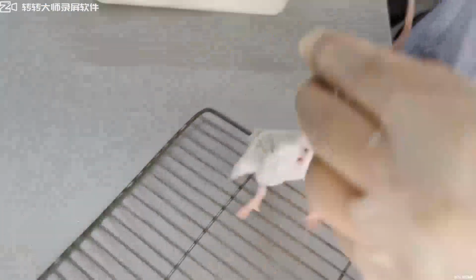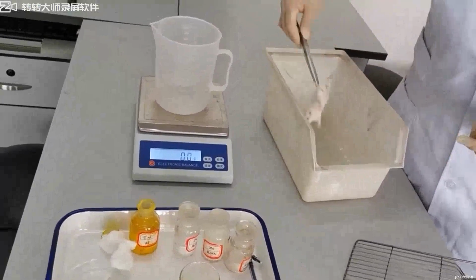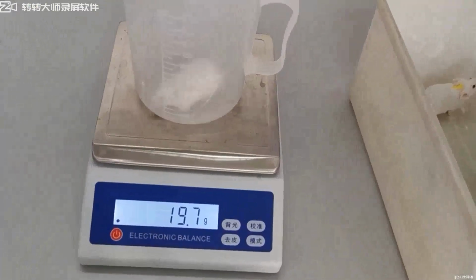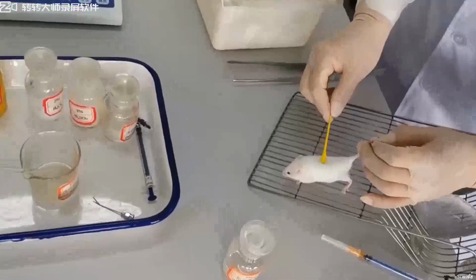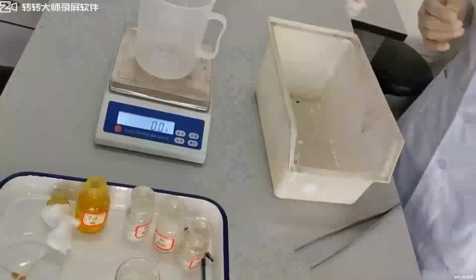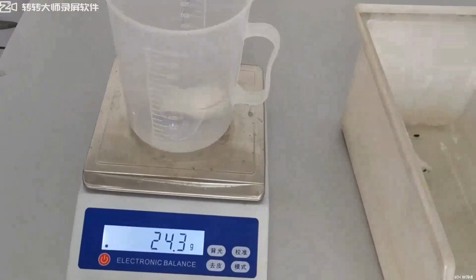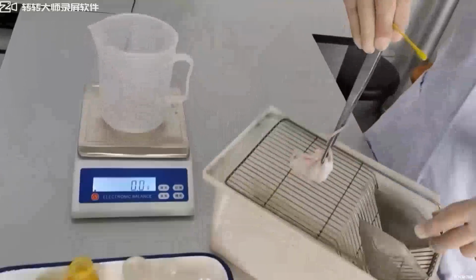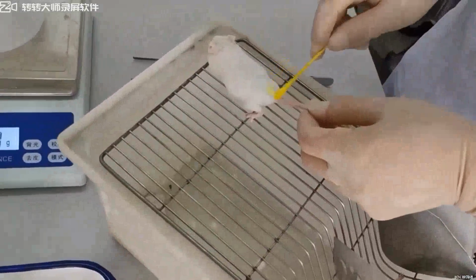This is number 5. Take another one. This is 20 grams. Give number. This is 6. Another one. This is 24 grams. Give it 7.